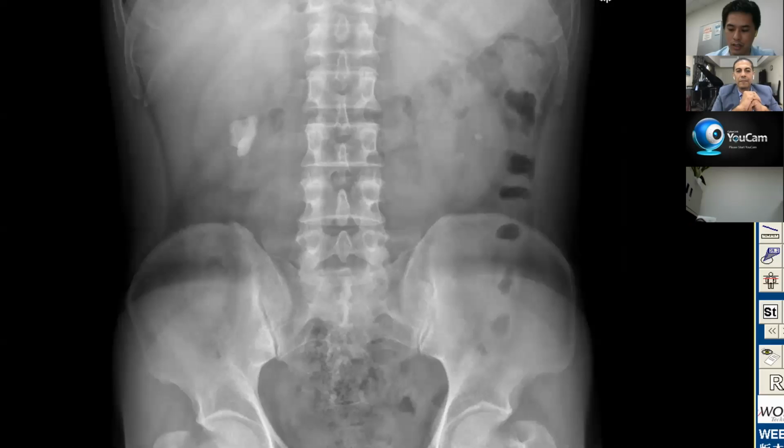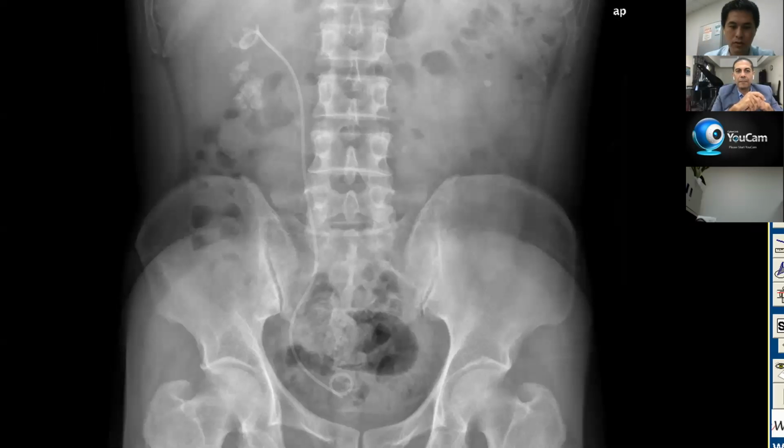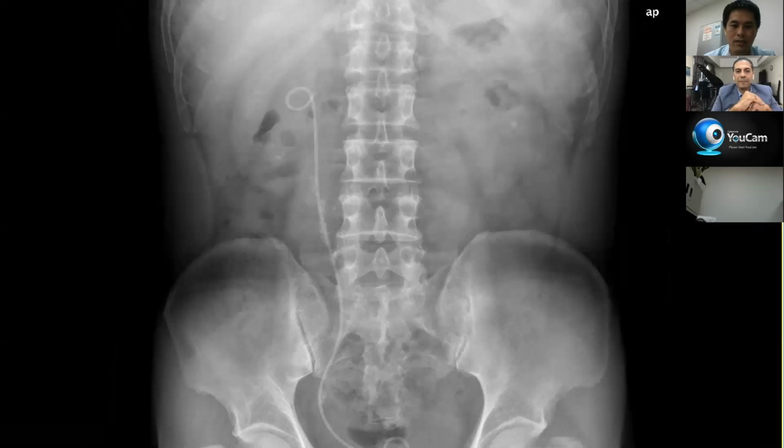Here we present a patient with a stone of around 3 centimeters. First, you can see we put in a ureteral stent, and then we did the first surgery. We can see the stones are torn apart, and then we did the 2nd surgery, and then we took the KUB. You can see the stones are moving out, and this is the last surgery. We can see all the stones in the kidney were dealt with successfully, I think.